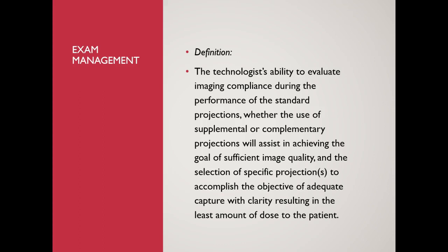And we have to ensure that the selection of specific projections to accomplish the objective of adequate tissue capture and clarity for the imaging exam with the least amount of dose to the patient. So as with any other exam that we do in radiology, we have to weigh that patient dose with having an optimal image.